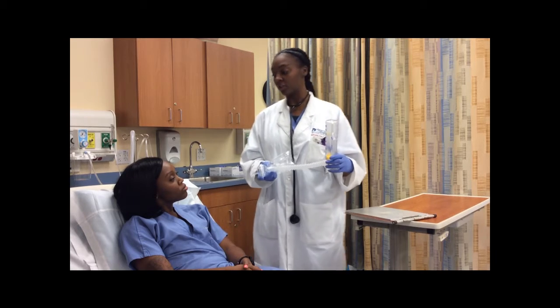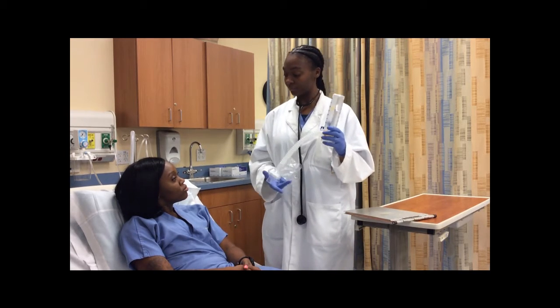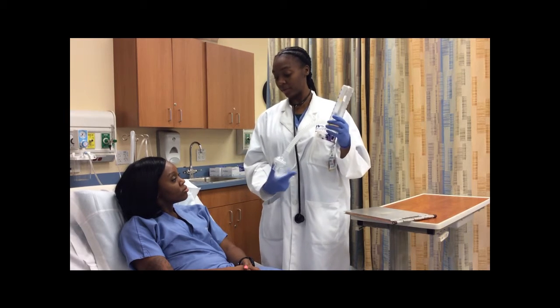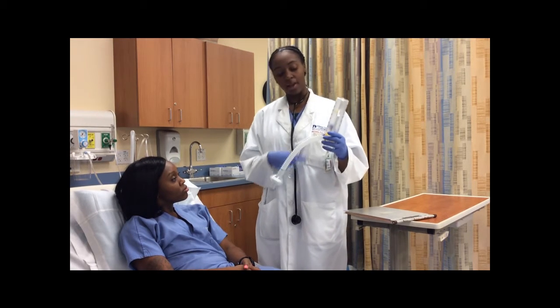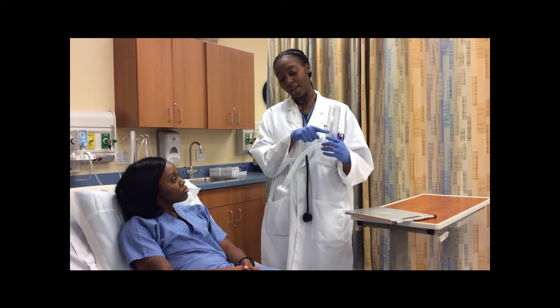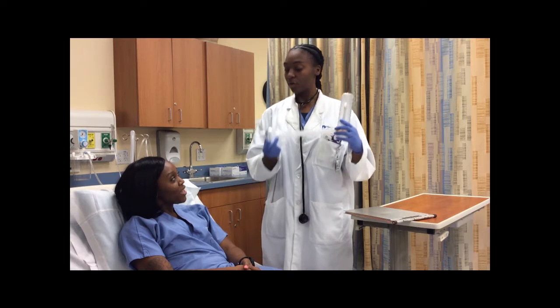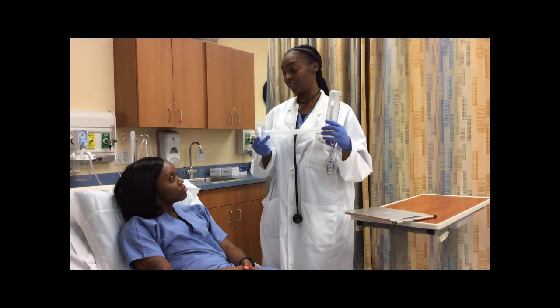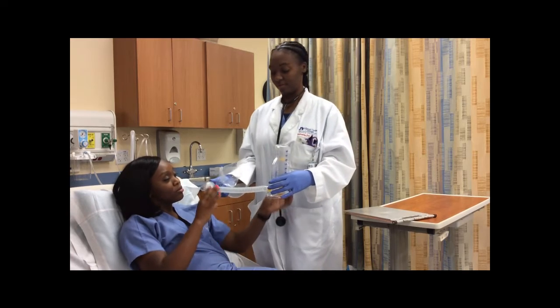What you're going to do is you're going to breathe in and out on your own. And when you feel comfortable, you're going to inhale. Seal your lips around the mouthpiece, inhale, and the bar is going to rise. But you have to make sure to keep the yellow piece in the happy face, okay? Once you reach your peak, when you inhale, you're going to hold your breath for 5 to 10 seconds, okay?